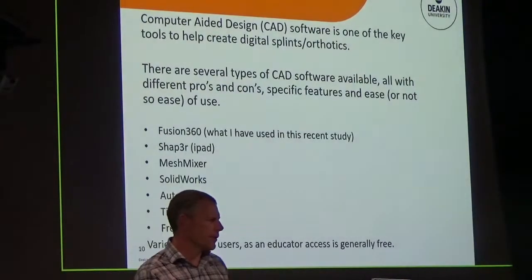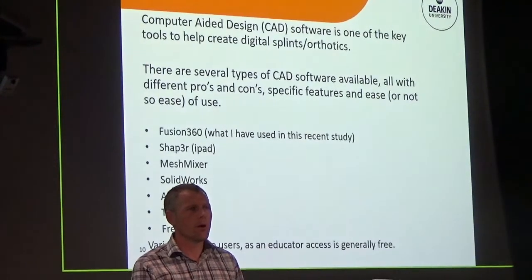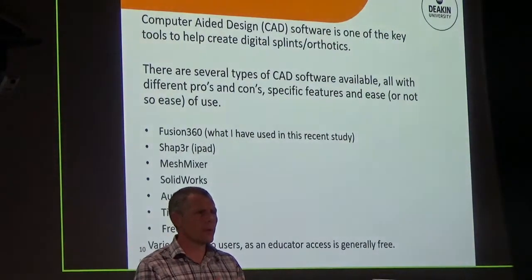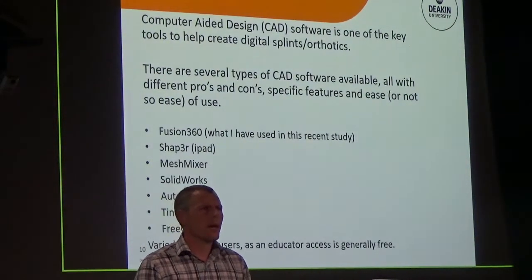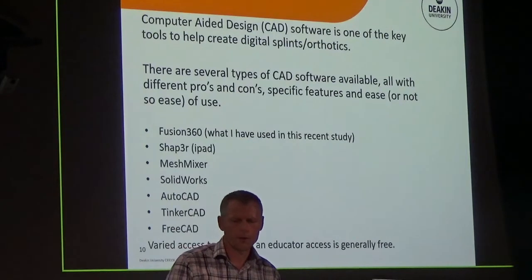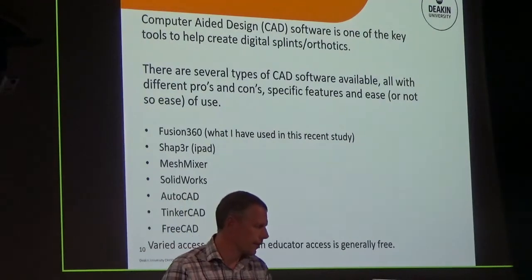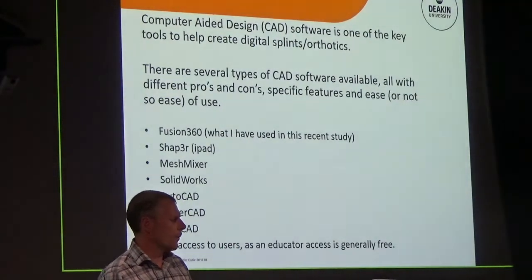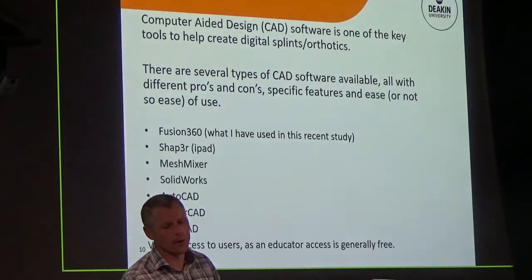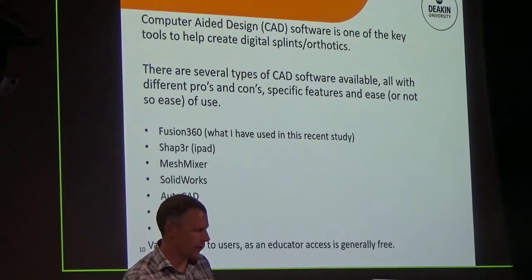And part of the process of it is the use of computer-aided design software. And this is a key component to creating a digital file or an image of a part of the body, and then going with it. So today I'm going to show you the use of that through some videos, and then talk it through as well. So there's lots and lots, if you want to have a bit of a look into these, lots of different types. There's pros and cons, and the ease of use of some really tricky things versus some not so tricky. The really good part about it is that you can actually look at the designs and test them out. And when I say test them, you can actually put force through them on the computer screen to see that they're strong enough to do what they need to do beyond just having a guess.